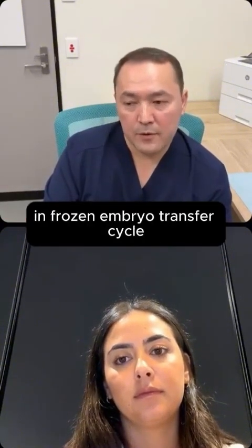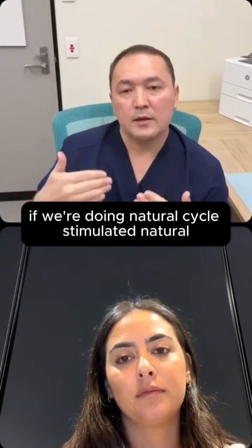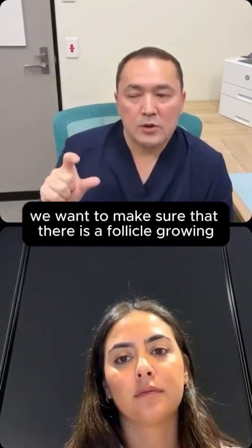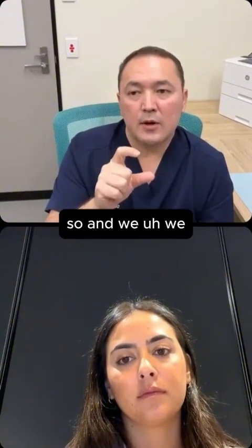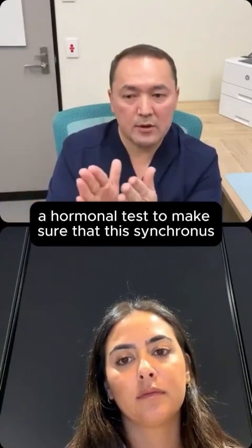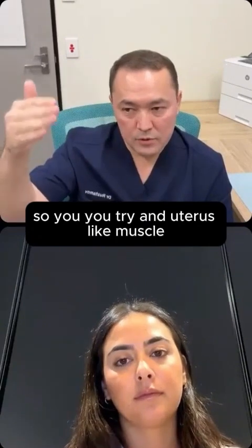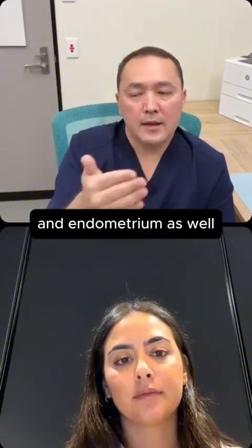In a frozen embryo transfer cycle, if we are doing a natural cycle, stimulated natural, modified natural, or letrozole natural, or just a simple natural cycle, we want to make sure that there is a follicle growing and that ovulation is happening. We use hormonal tests to make sure that this synchronous follicle growth is happening and ovulation is going to happen. And we also check the endometrium again, and the uterus muscle, to rule out adenomyosis and fibroids, and the endometrium as well.